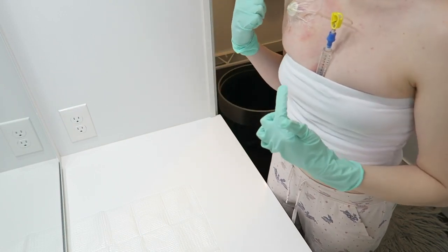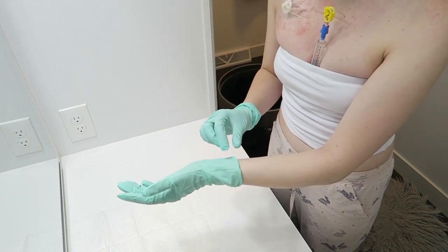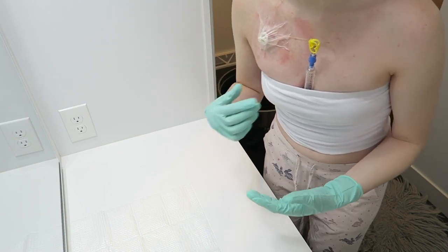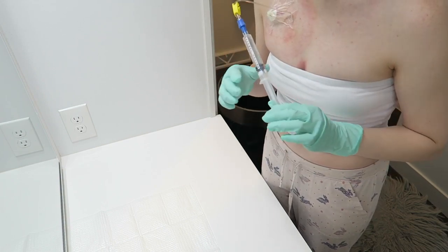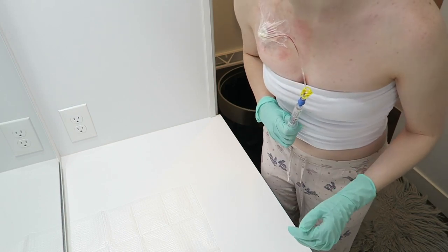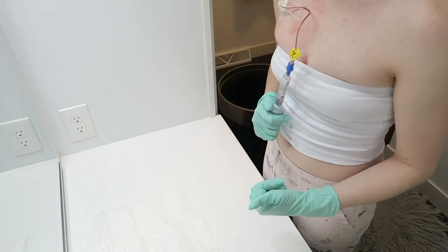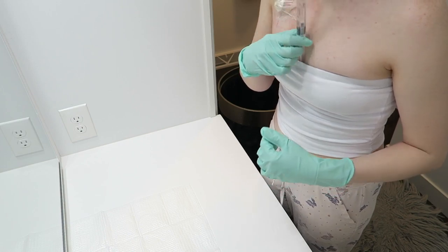However, before I do that, because we were kind of messing with it, we're gonna go ahead and check for blood return again. Technically, I am no longer sterile and I don't need to be sterile, but I was touching my skin and stuff, and obviously this was in my shirt, it's not sterile, but because it's covered, this is no longer sterile. So as you can see, I pulled back and I got blood return. That is perfect. So now we're gonna go ahead and flush that back. And we're gonna go ahead and put the second bandage on.